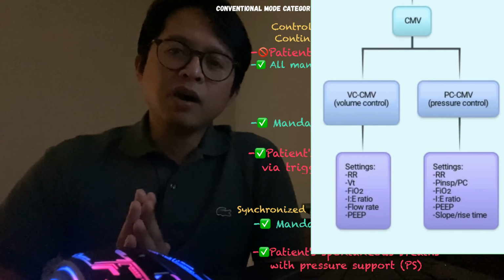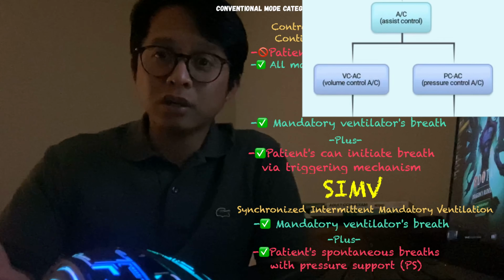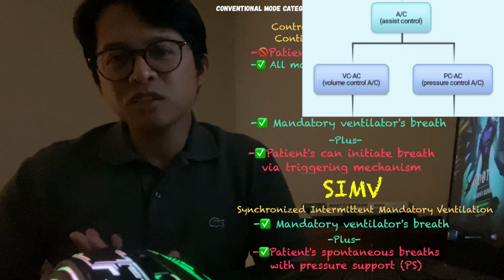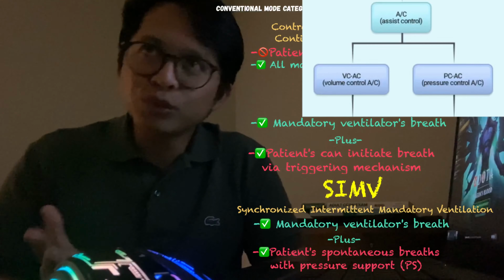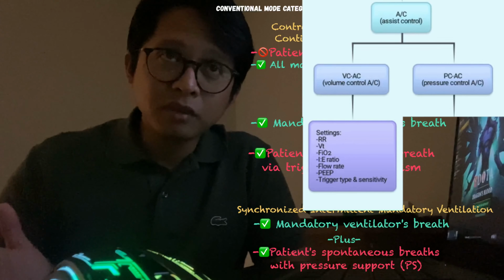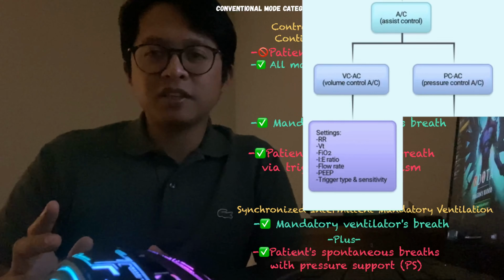Okay, now when we talk about AC, this can also be achieved through volume control or pressure control. It doesn't change how assist control works. In assist control volume control, the possible settings are FiO2, RR, VT, IE ratio, flow rate, PEEP, and additional patient-triggered type and sensitivity.